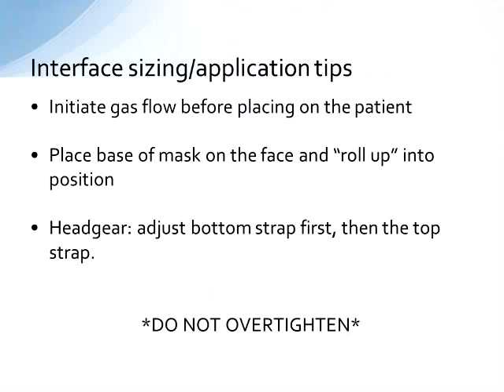So, just general sizing and application tips, regardless of what device you choose. You want to be sure that you initiate gas flow on whatever unit you've chosen before putting the mask on the patient. Many of these masks sort of puff up, at least at the junction where it would touch the patient's face. And if you put it on the patient before you turn on the flow, you very often will have it too tight, and it doesn't allow the mask to puff up and seal all the leaks that could be present there. So you have to let the mask do its job, and the way to do that is turn on the gas flow first. The gel masks don't really do that, but you still want to turn on the flow first.